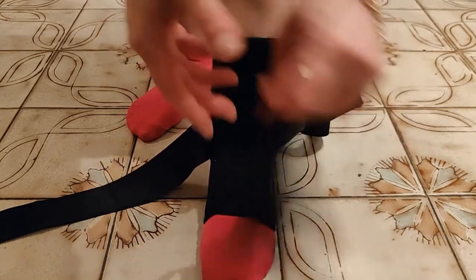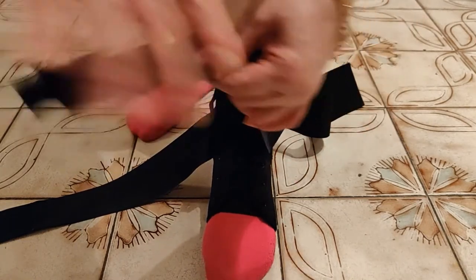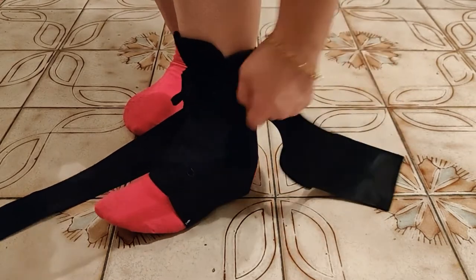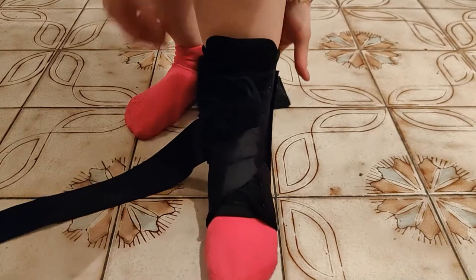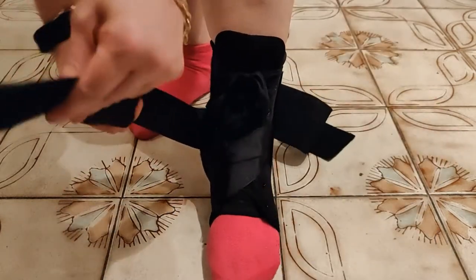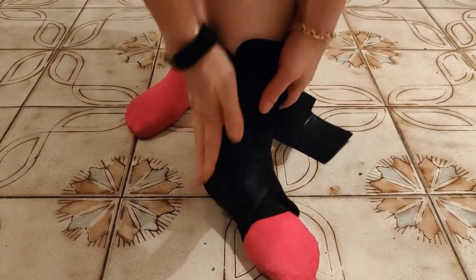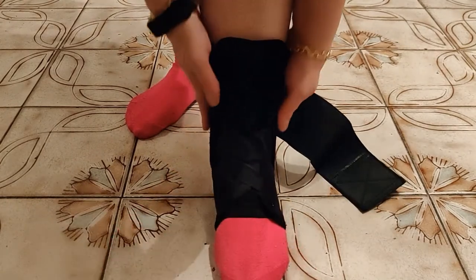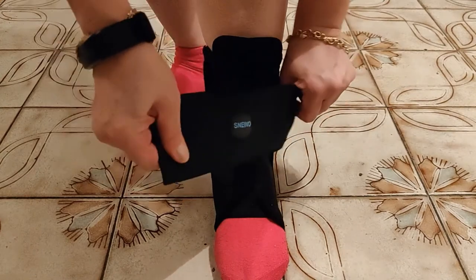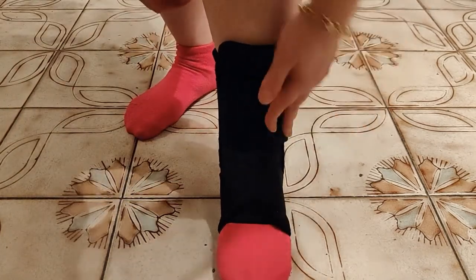Here comes the fun part. You're going to take the left strap, make sure the rough piece is facing down, take it and pull toward the right, tuck it under your foot, pull and Velcro to the side. You're going to do the same with the right — make sure the rough part is toward the bottom, pull, wrap it toward the left, wrap it under your foot, and Velcro to the side. There you go — the two supporting sides. You can make this as tight or as loose as you need to. Then you're going to take the big strap, which is an elastic band and very sturdy, pull it around your calf and Velcro it here.